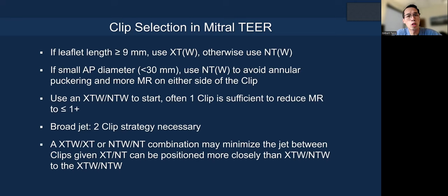How do you select which clip to use? We first go by leaflet length. If the leaflet length is nine or more millimeters, we tend to use the longer clip — the XT or XTW. Otherwise, you use the NT or NTW. It also depends on the mitral valve area and starting gradient, because sometimes even though the leaflets are long, you might not want to use the longer clips because it can risk mitral stenosis.